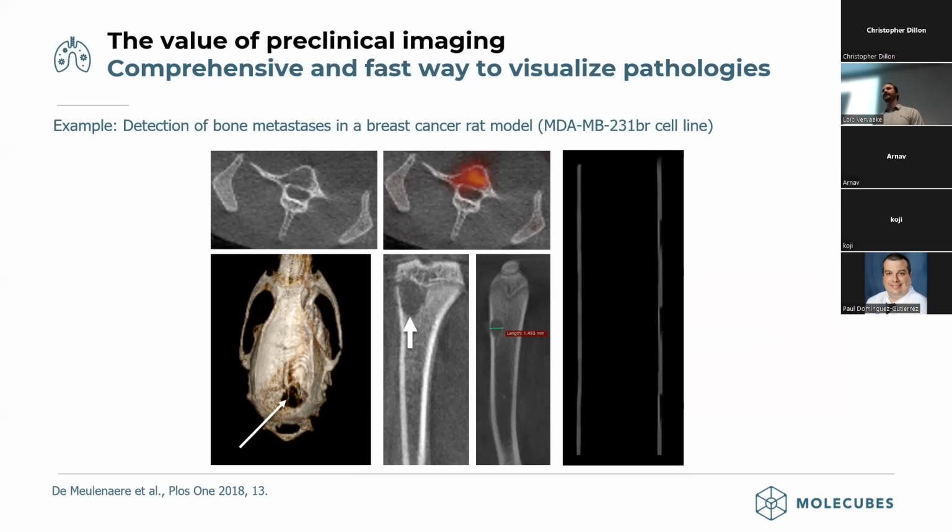Without actually knowing what was going on, they resorted to a quick 20-minute PET-CT study, with a regular FDG tracer, and basically saw immediately that there were metastases throughout the body of the animal. This can be seen in two ways. In a PET-CT study, when you do the CT image and then the PET image, on the CT you would have, for example, the clear holes in the bone here, where you can see the necrotic tissue.